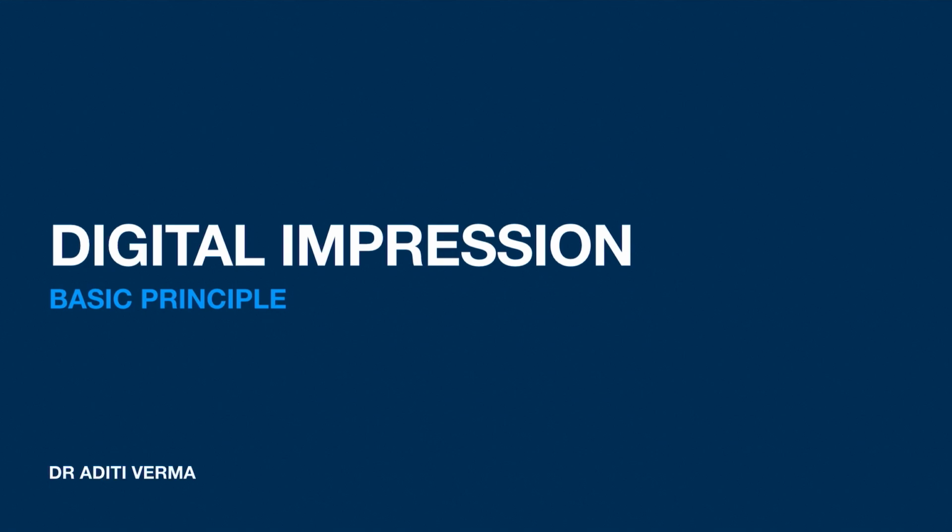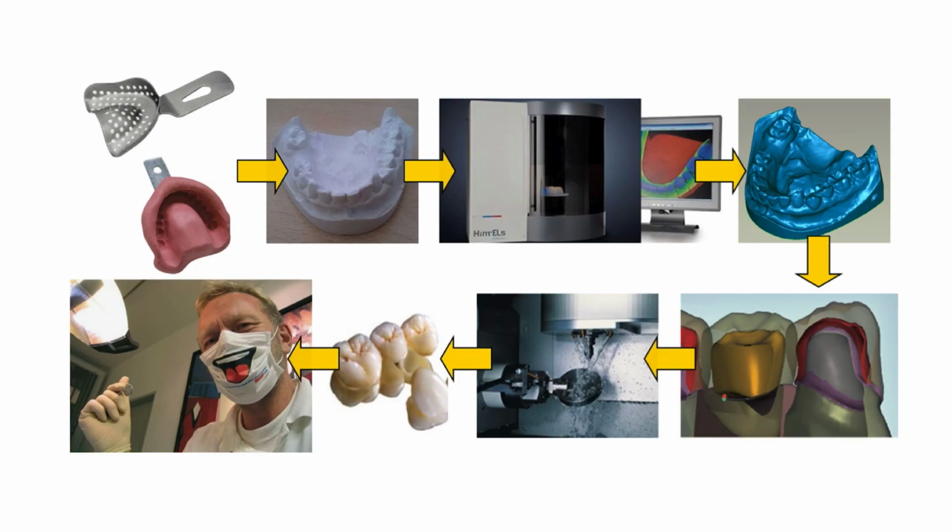Welcome to today's video where we will explore the basics of digital impressions and how this cutting-edge technology is transforming modern dentistry, from capturing precise 3D images to ensuring accuracy in dental restorations. Let's dive into the foundational principle behind digital impression. So we will start with the first and most traditional approach.